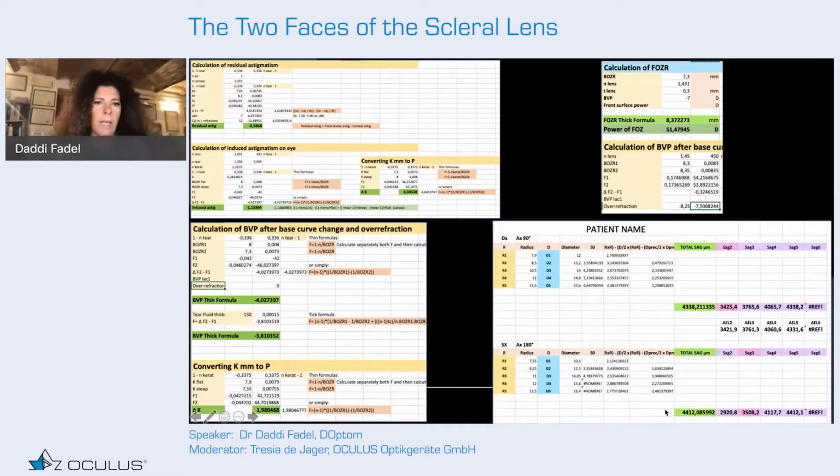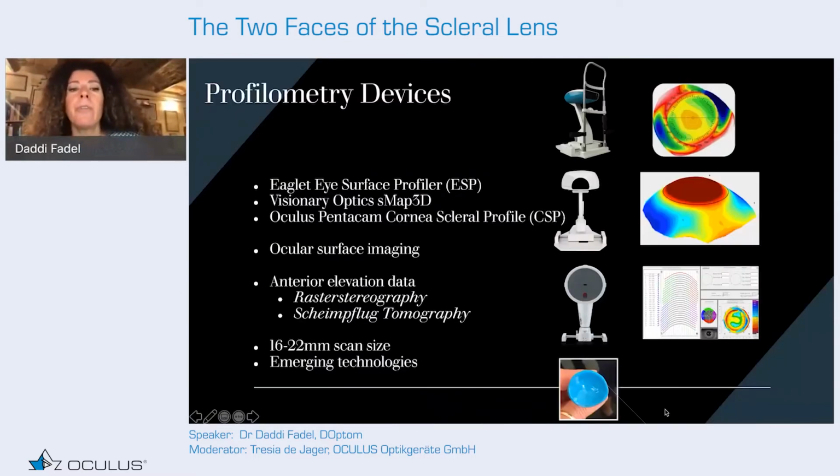However, even with the Excel sheet, this method is too time consuming. Scleral lens topographers provide several parameters important for first-line diagnostic selection, and also allow you to send the scleral topography to the different labs, so the labs can customize the lens in empirical fitting. What is different with Pentacam is that you have the possibility to design the lenses with an incorporated software.